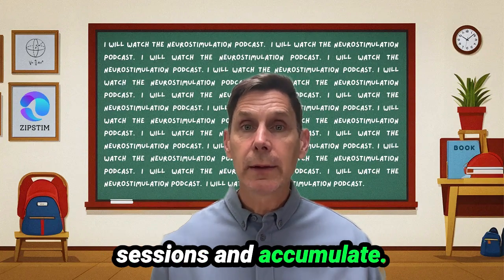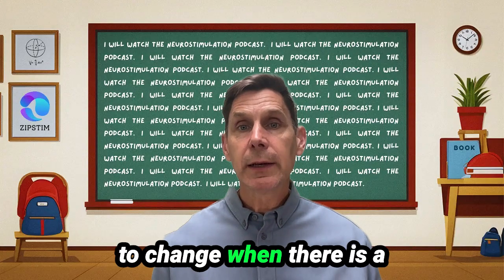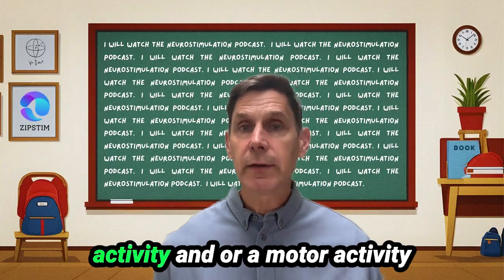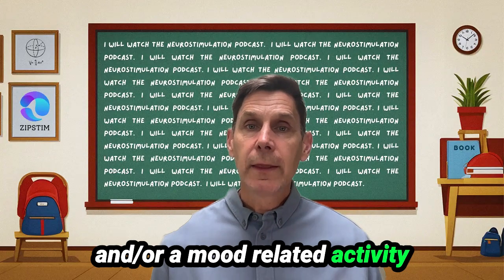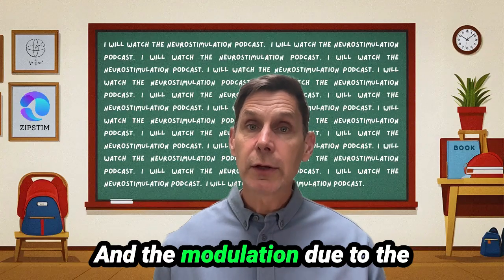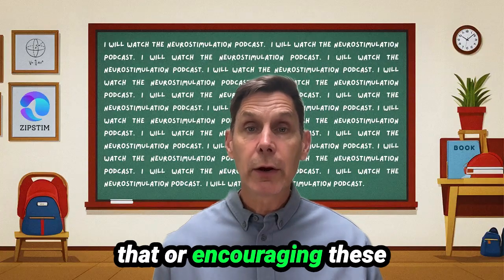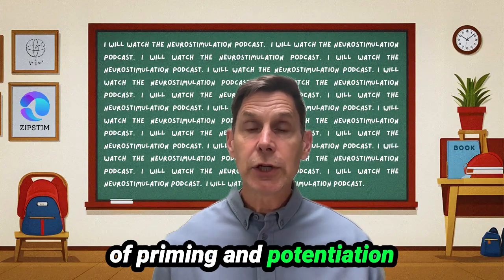The brain seems to respond best when there is a volitional kind of activity, whether that's a cognitive activity and/or a motor activity and/or a mood-related activity that the patient is attempting to do simultaneously. And the modulation due to the tDCS seems to be facilitating or encouraging these changes by way of the kind of priming and potentiation that we've been talking about.